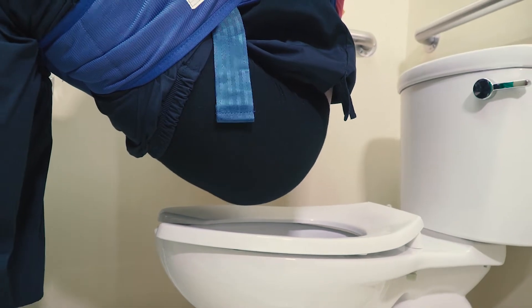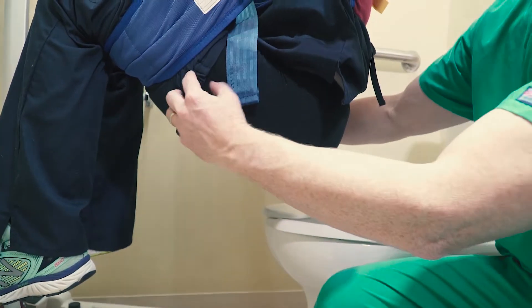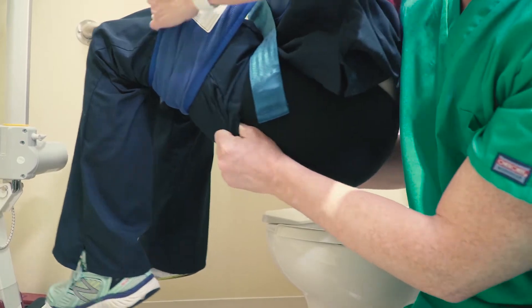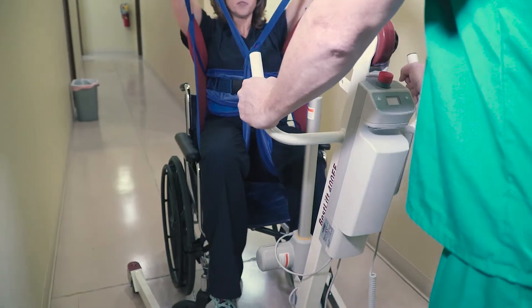With one hand on the patient and one hand on the lift controls, slowly begin lifting the patient. With the patient raised, you can assist them with wiping or other hygiene before pulling the patient's pants back up. You can now return the patient to their chair.